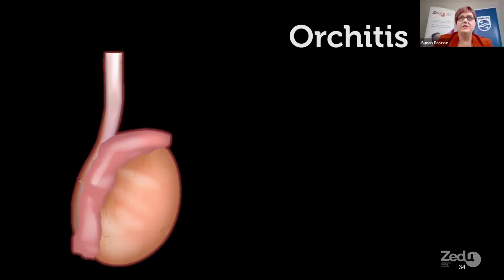Do we know, Suean, whether the other testicle, like there may be still flow on that side, but how did it compare to the flow on the other side? I'm assuming that it was reduced, but I haven't got the other picture of that one, unfortunately, to show you.